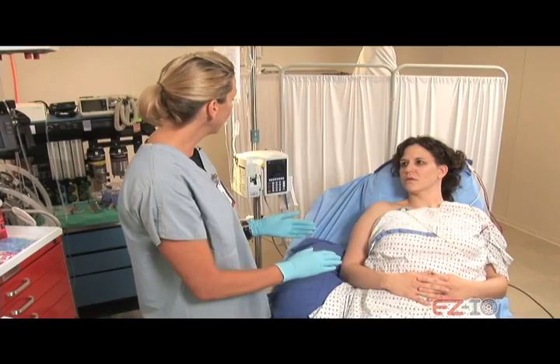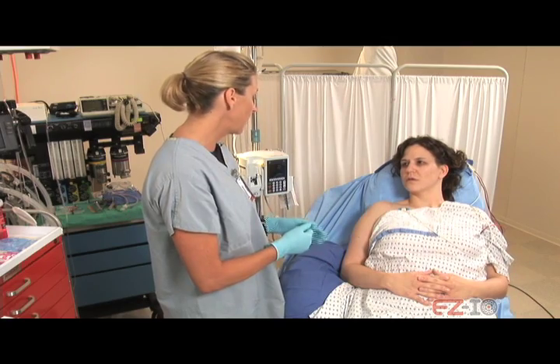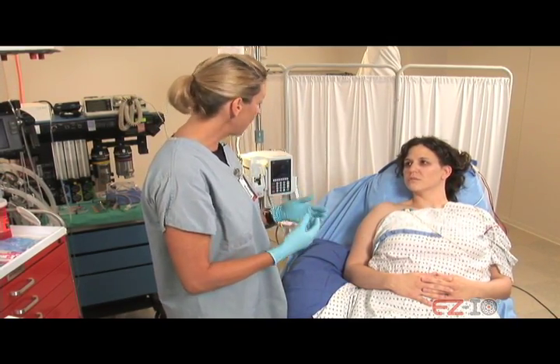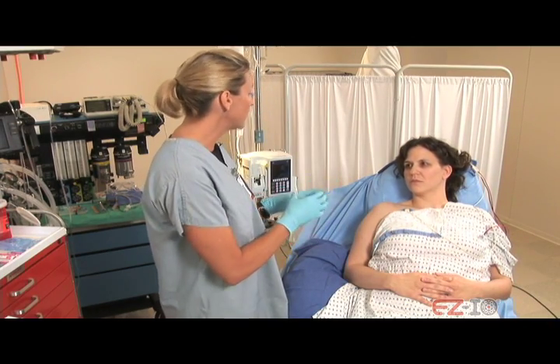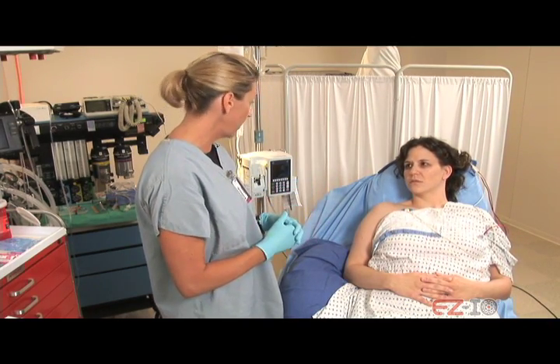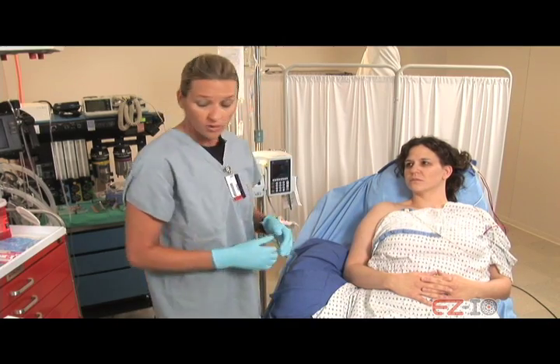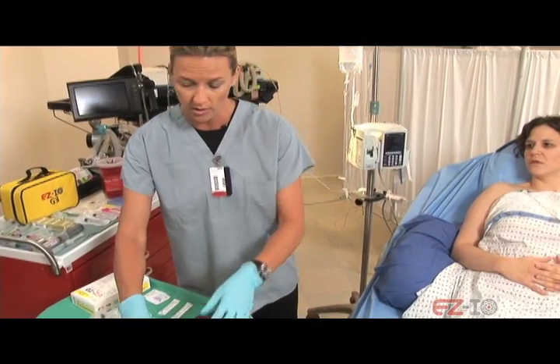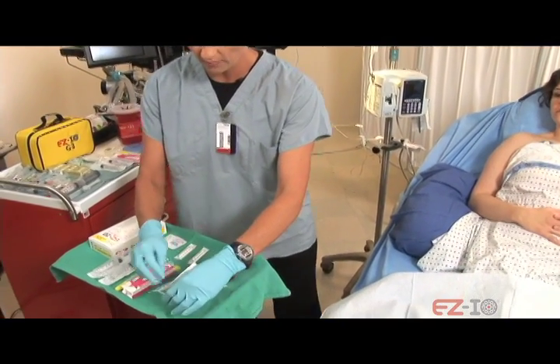Okay, so Karen, we were not able to get IV access, so what we're going to do is get vascular access by putting it into the bone. So what you're going to feel is it feels a lot like an IV when it's going in. You're going to feel a little bit of pressure when it's going into the bone, and then I'm going to give you some medication once it's in there that's going to help to numb that area up so you won't feel anything after that, okay? Okay. So are you allergic to any medications? Just penicillin. Penicillin, have you ever had lidocaine before? Not that I'm aware of. Okay, all right.